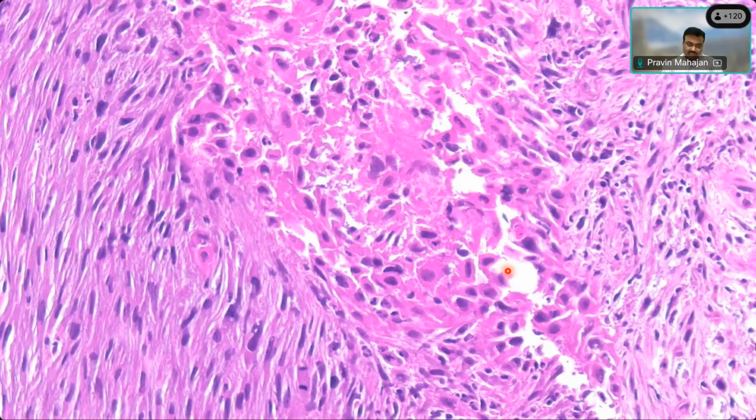So definitely they have a morphology which is polygonal, has very eosinophilic cytoplasm and nuclei which are hyperchromatic, irregular. Some cells have this keratin-like trail also. So these are definitely squamous cells. They do look atypical or dysplastic. So within this tumor, you are seeing some island which has a very epithelial appearance, having a squamous morphology and looks like a dysplastic thing.